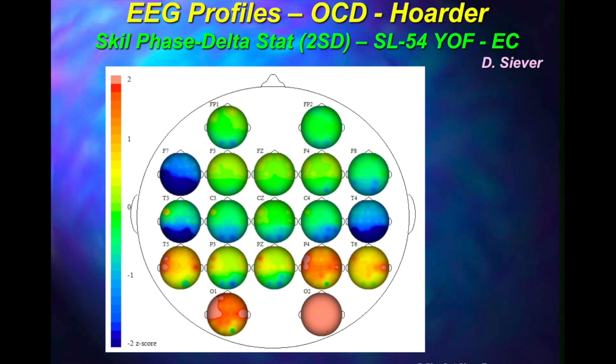And you can see here what we're looking at. We have blue areas and we have hot pink areas. What this means is between the blue areas and the pink areas, there's a dramatic change in one direction: the signals going one way, and they're faster going the other way. And so there's damage in one direction. And often there's a fair bit of left-right stuff that shows up, and we certainly see this happening between O2.